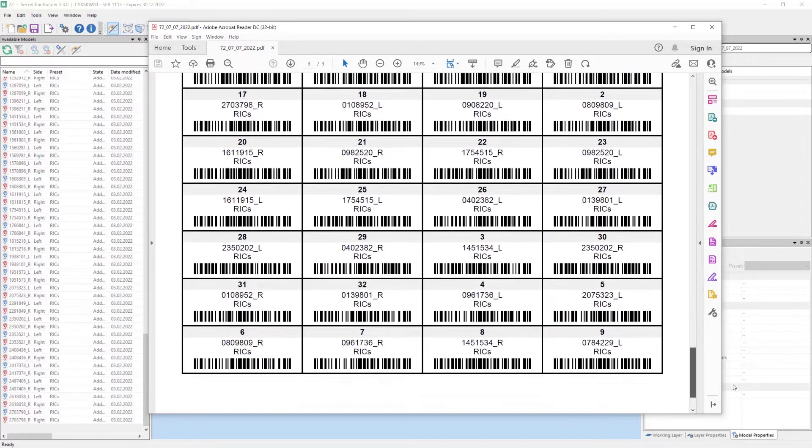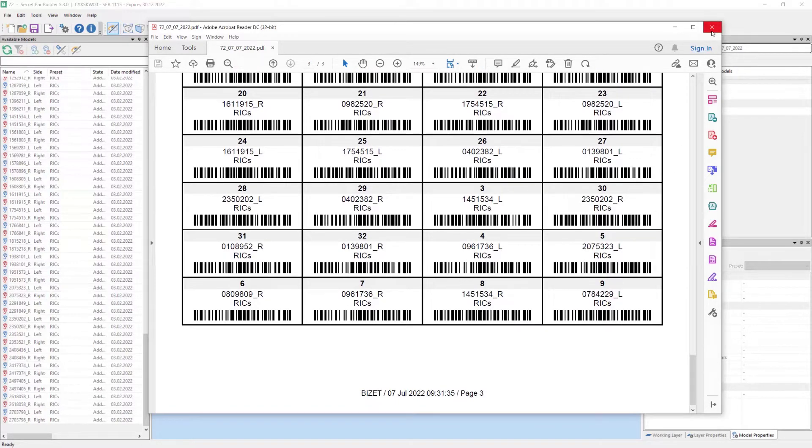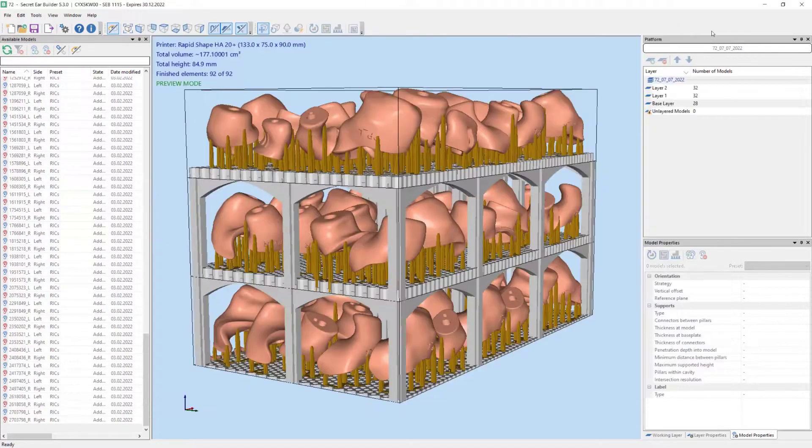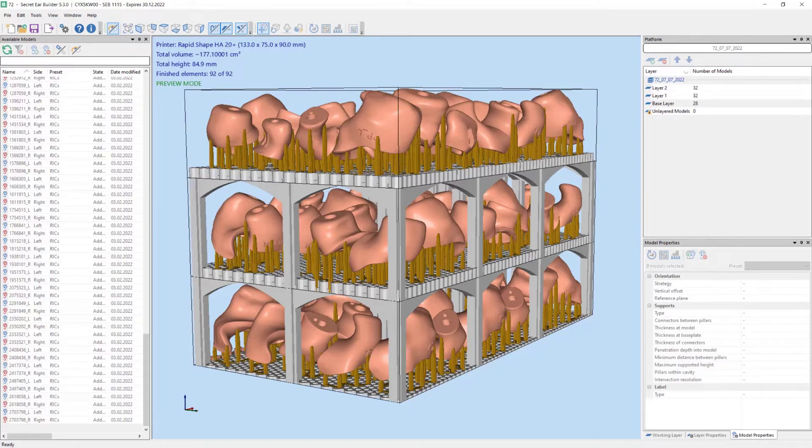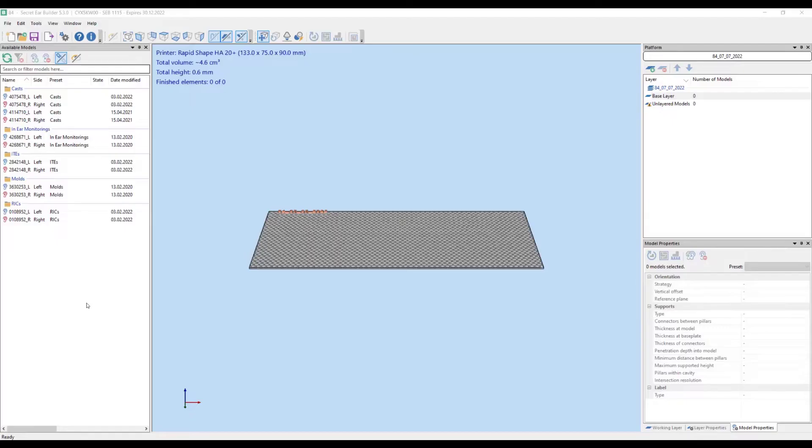Cyfex Secret Ear Builder creates build jobs within minutes. Creating and fine-tuning a single layer build with RICs, ITEs, skeleton ear molds, IEMs and injection molds.